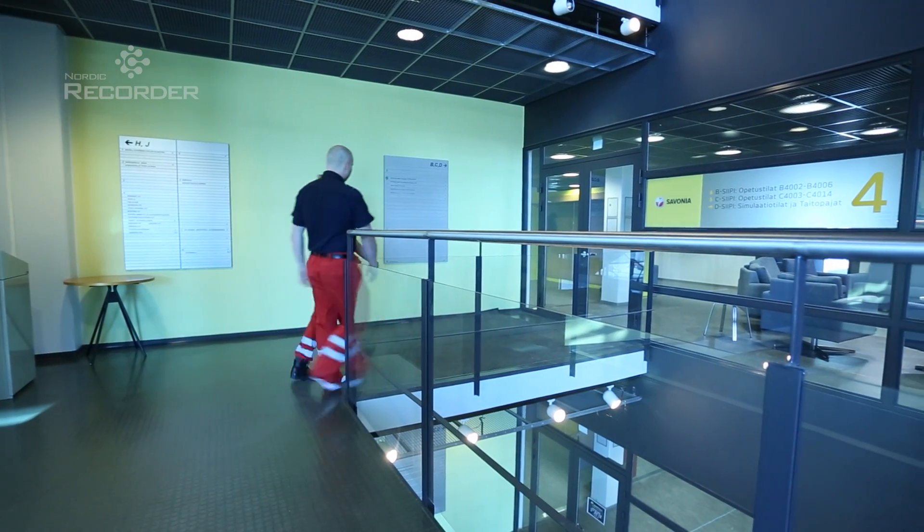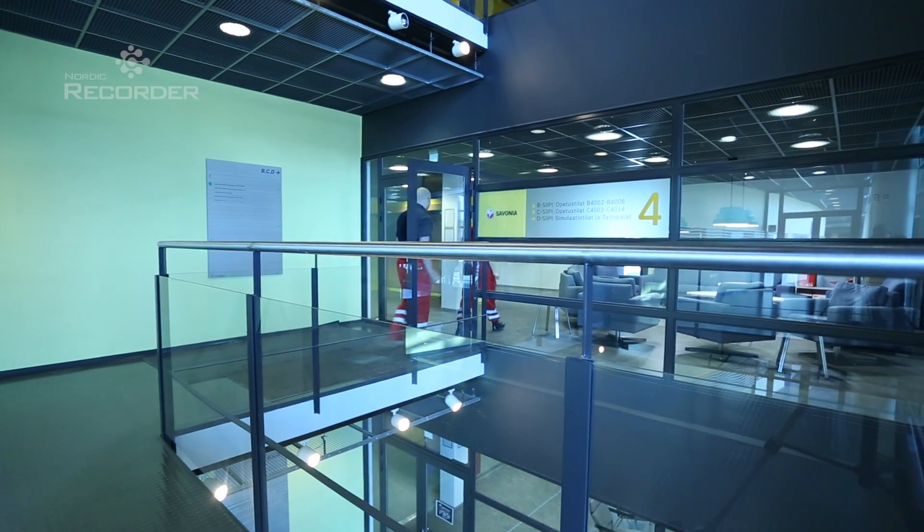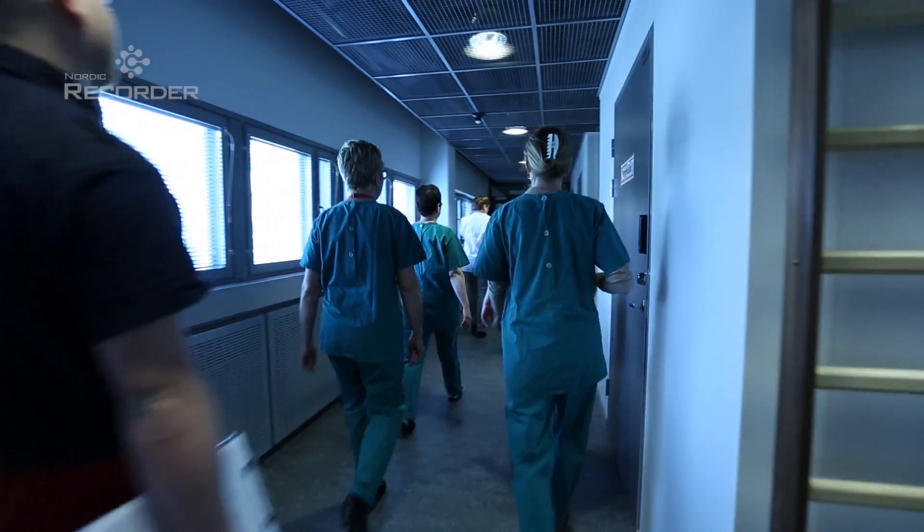Choose a reliable, innovative and professional partner. Choose Nordic Simulators, allowing you to focus on the medical aspect of the exercises while the technology takes care of itself.